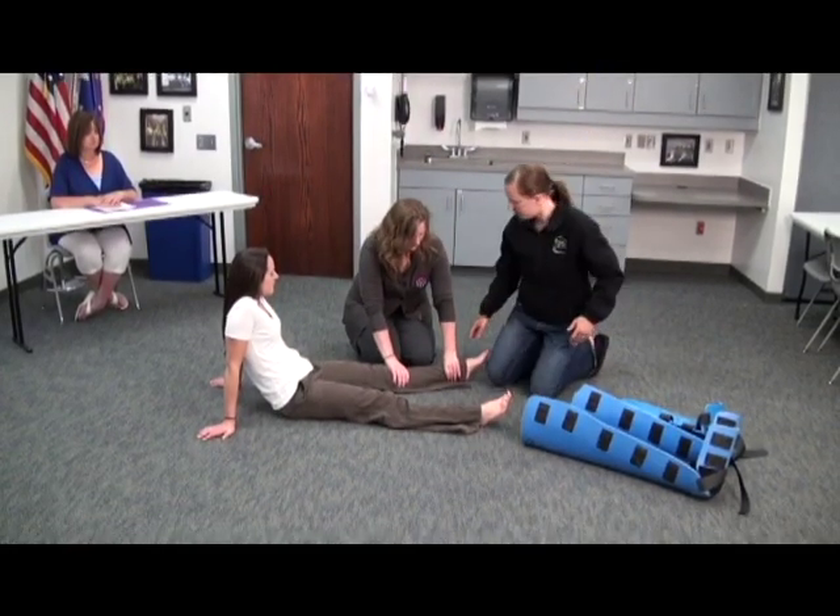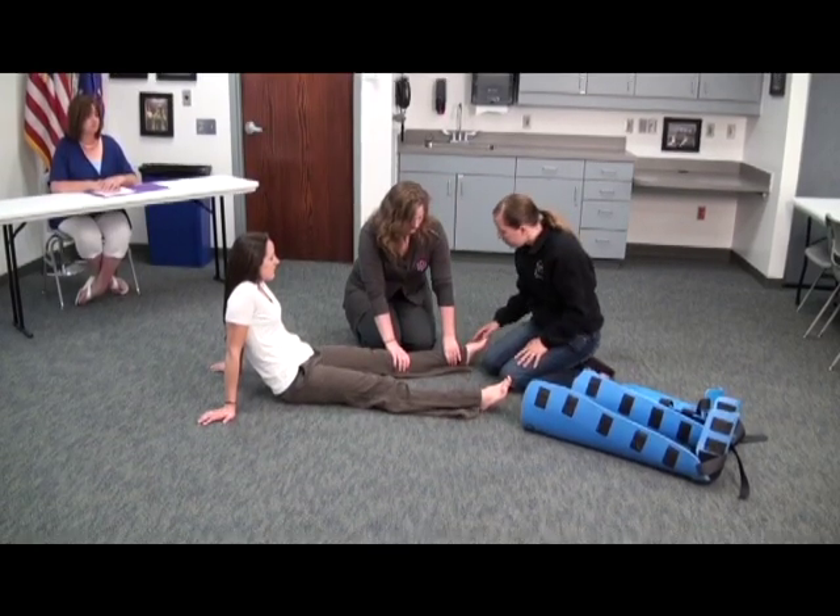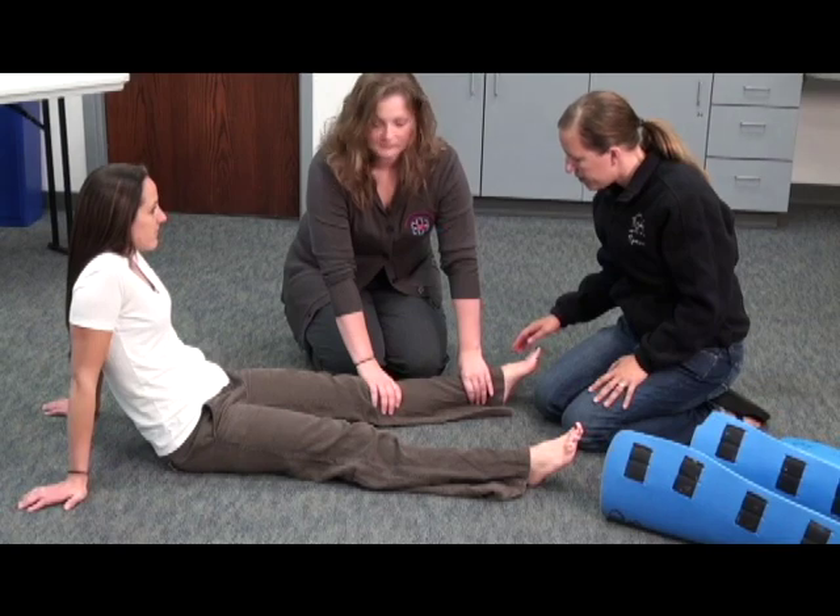I'm going to come down and check CMS. Does she have a good pulse? Ma'am, can you feel me touching you? Yes. And can you wiggle your toes for me? Okay.